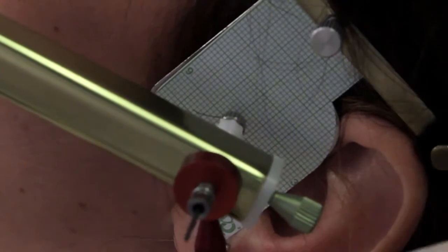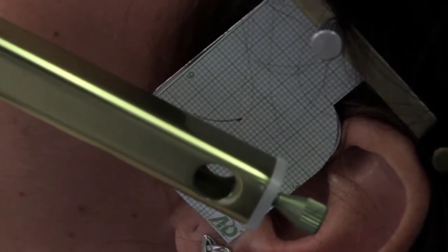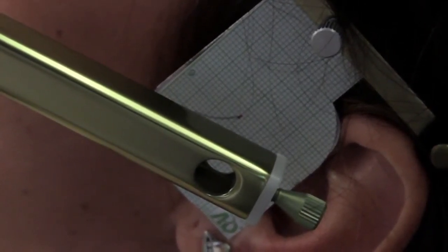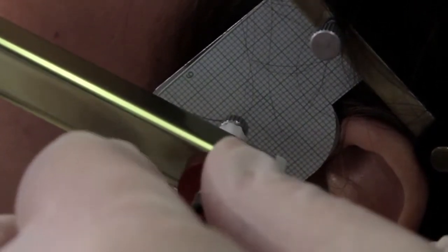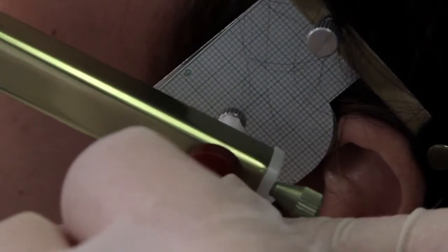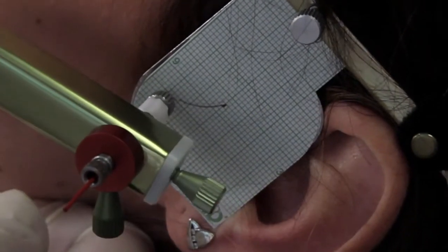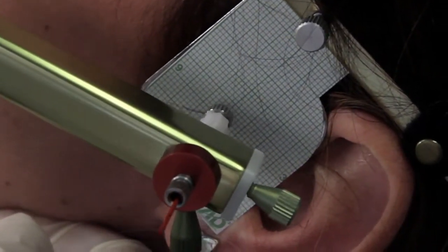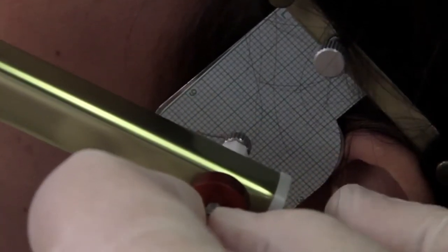Okay, put the red writing pencil in. And we're going to do the orbiting, right orbiting in red. That way. Now then, move to your right, please, Ali. Keep your teeth together. Do it again. One more time. Go back, all the way back. Atta girl. Stop. Okay. Now take it out. That's good. Okay.